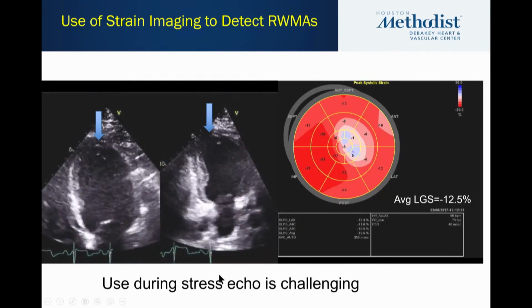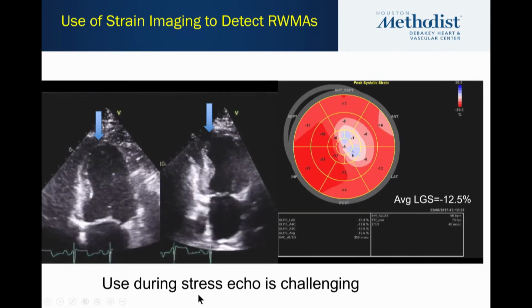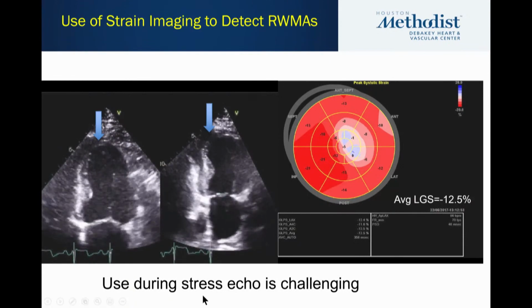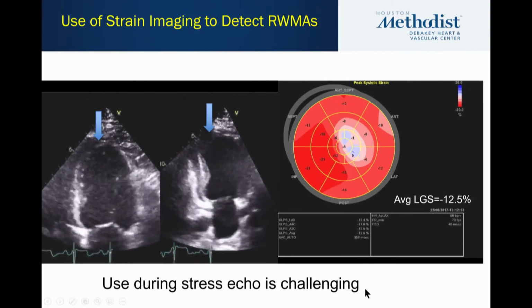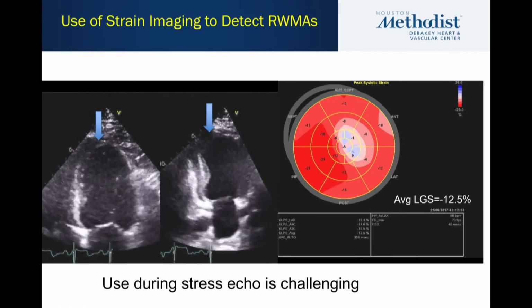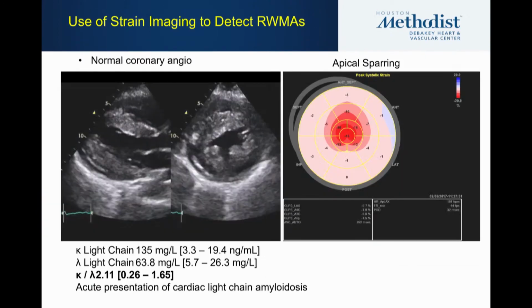As exciting as this looks, I have to tell you that the use of this technology with stress echo is still challenging. And with exercise, it's very hard, and we're still struggling to make this work, because it would be nice if it did. It would be one way of making stress echo a little bit more objective and away from the eye. But again, stay tuned.